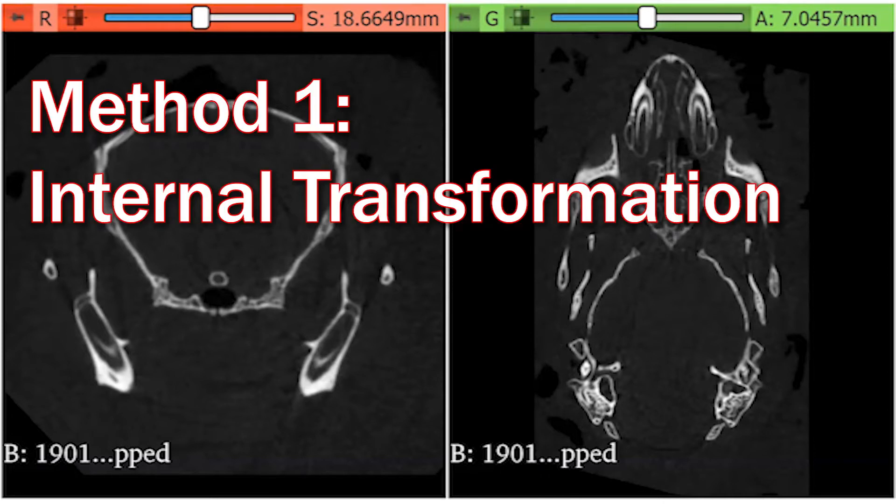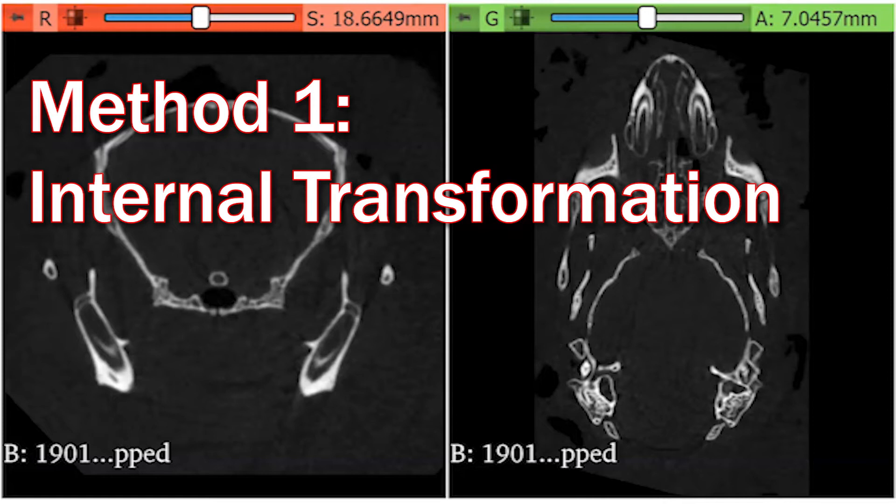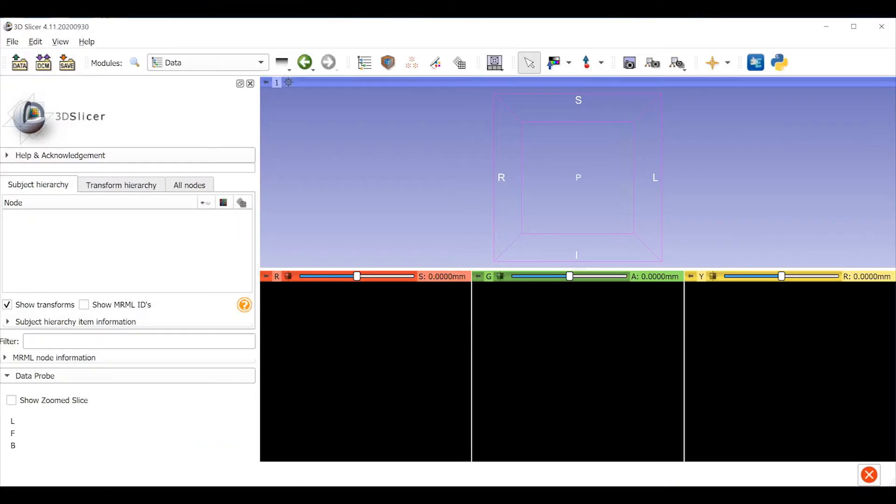First, I'll show you the simple method. This is good when you will only be working with the data in 3D Slicer, so I think of it as an internal transformation of the data.